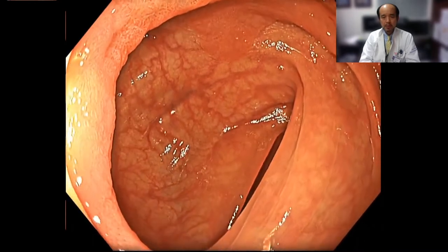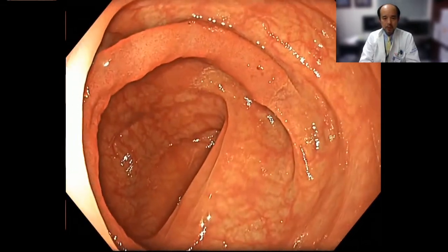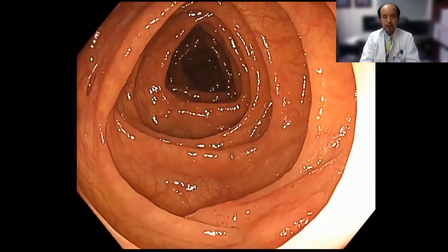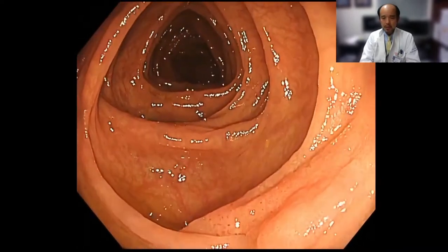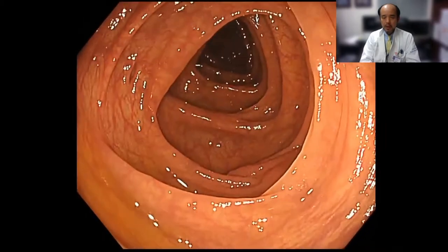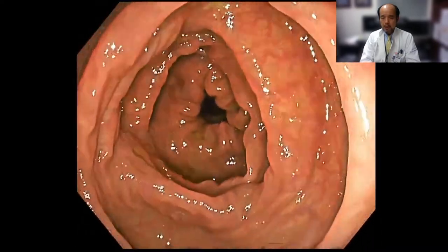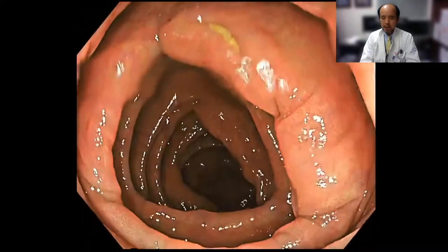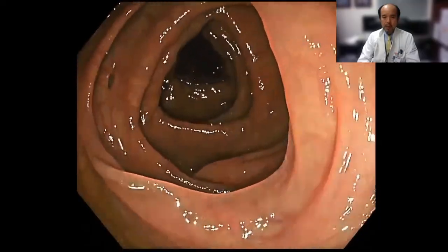This is also very helpful for the screening colonoscopy procedure. I'd like to show you one video clip for screening colonoscopy. Can you detect any lesion with this white light image? Probably you already recognized there is a flat lesion here. By using TXI mode 1, we can recognize that lesion more easily. You can easily recognize this very flat lesion. This kind of flat lesion can be easily missed using white light, but we can nicely visualize it using TXI mode 1.